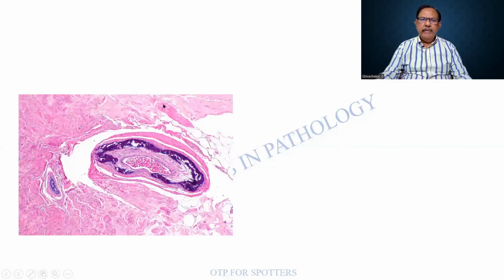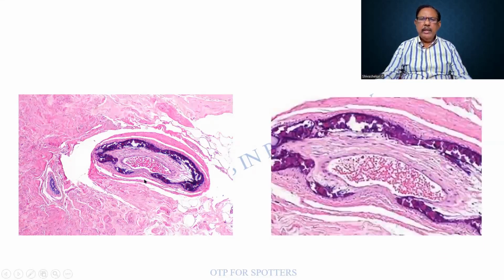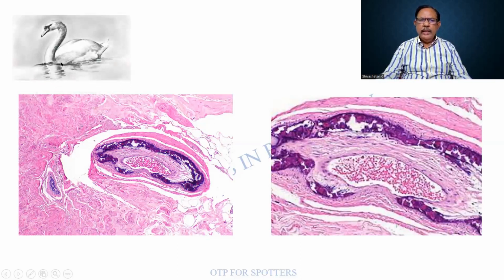On the screen, I am finding an eosinophilic material, which means connective tissue. And there is also another structure which is elongated and slightly curvilinear. At a higher magnification, I am able to make out that this is a blood vessel because the media I can see, the endothelium I can make out, and the RBCs. In the media, there is amorphous, basophilic, acellular material that is being deposited. All this gives rise to a swan neck-like deformity or a rigidity of the blood vessel.